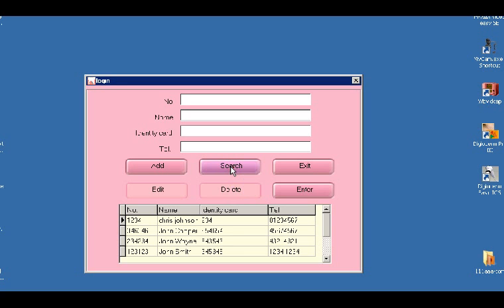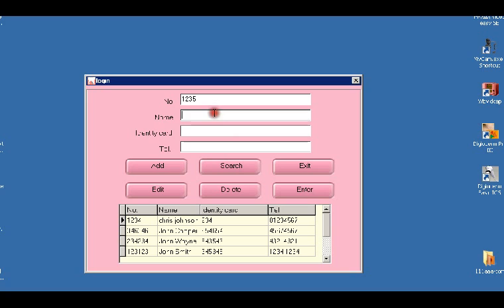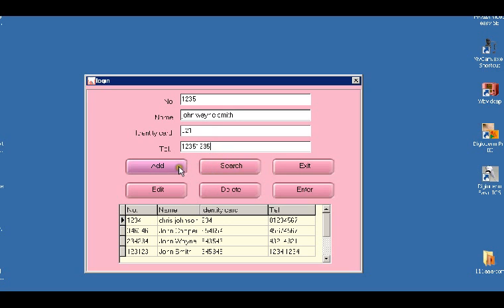So I'm just going to add my own record: number 1235, name John Wayne Smith, ID card 321, telephone number 1235-1235, and add.